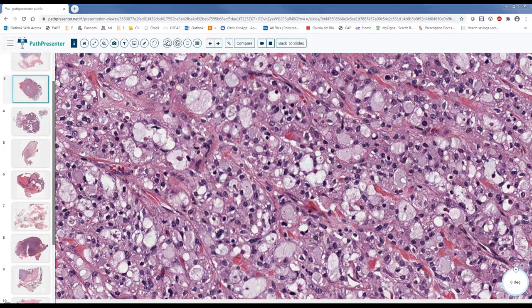All right, let's recap mammary analog secretory carcinoma, or what we call it right now. I'm sorry, I did my training in the era of mammary analog, so it sometimes still sticks with me. What I do, to be honest, is put secretory carcinoma, open parenthesis, mammary analog secretory carcinoma. That is basically a message for the surgeon. You can't give them a lot of nomenclature very fast.